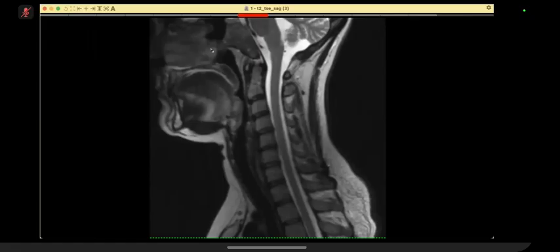Okay, doctor. So the last case diagnosis was infection. It was an iliopsoas infective process. Right now, there was no abscess, but there was myositis, infective myositis. That was infection. And there was no discitis with it. Okay. Over to you.